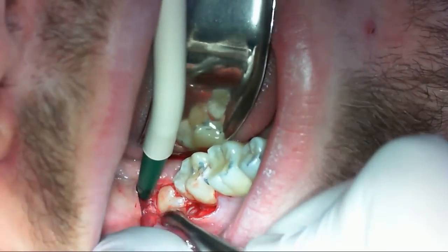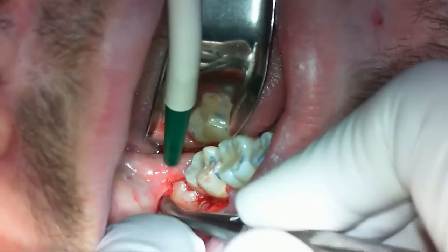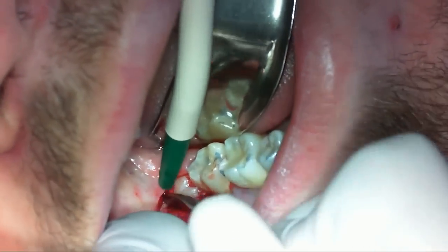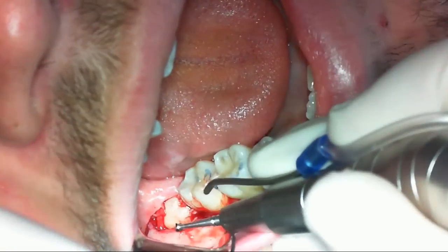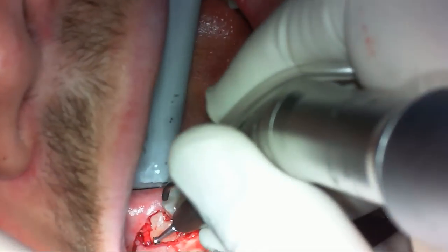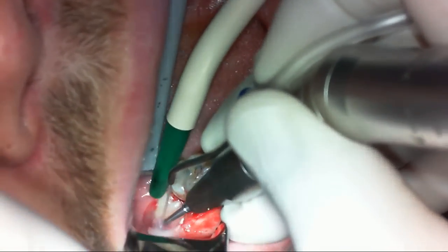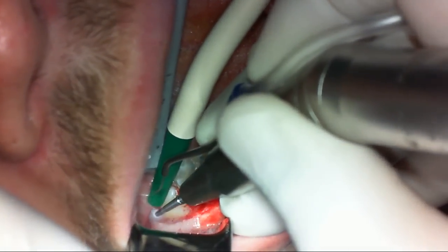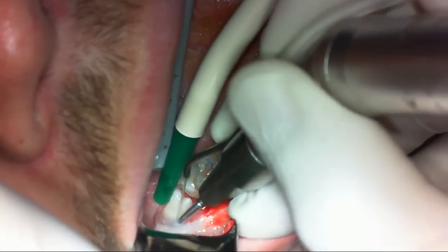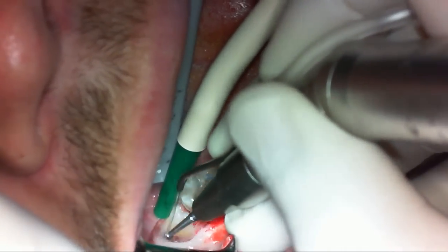During our courses we often get asked: when do you gutter and when do you remove distal bone? The idea of guttering is to remove some of the cortical bone buccal to the tooth — since we don't have a lot of movement in this area, we get into the cancellous bone where it's softer, allowing some movement. This also minimizes pressure on the lingual plate and the IAN — the idea is to minimize pressure on those vital structures.